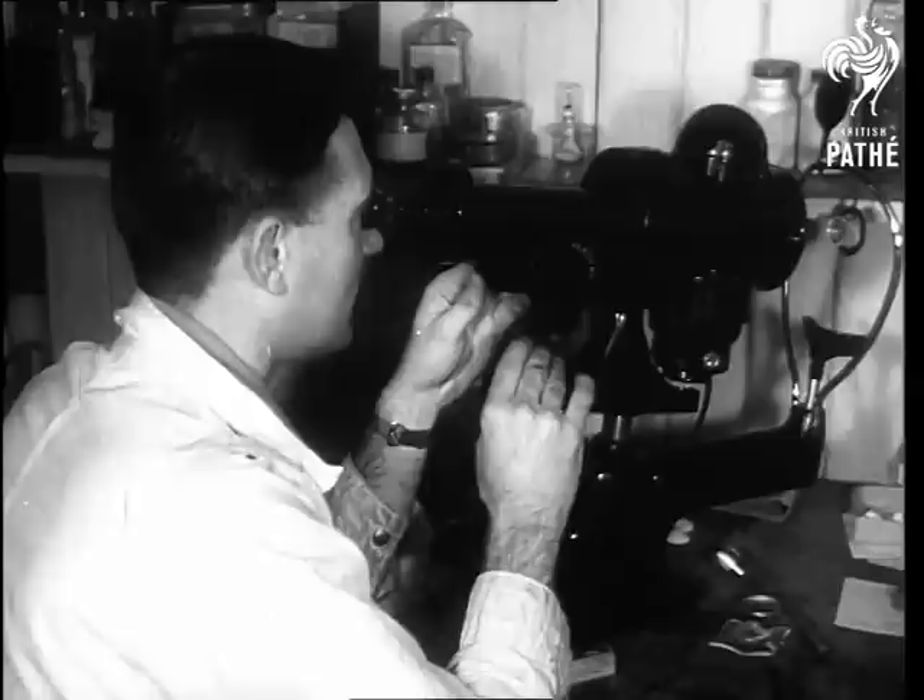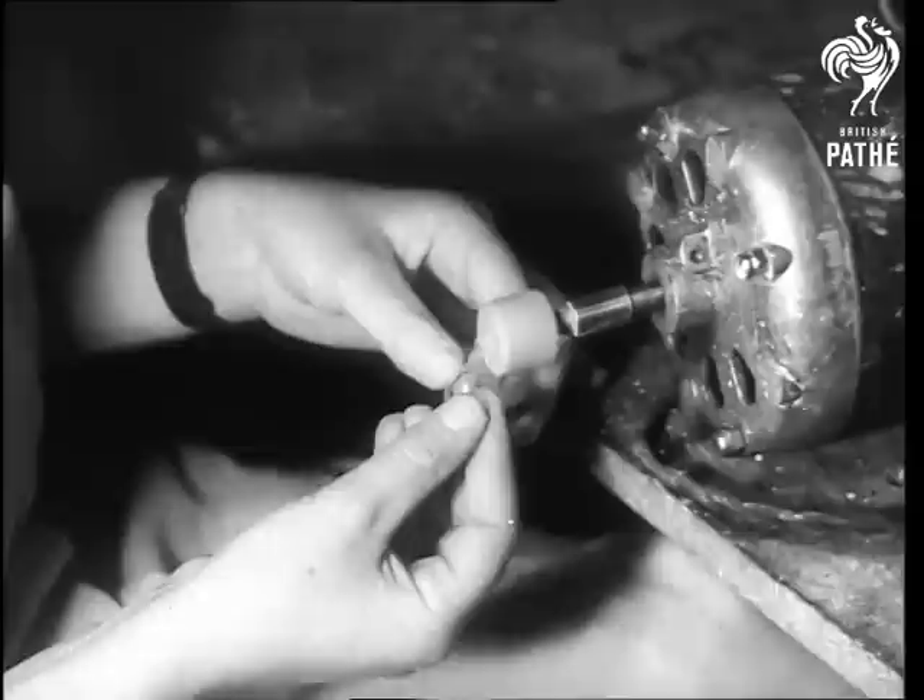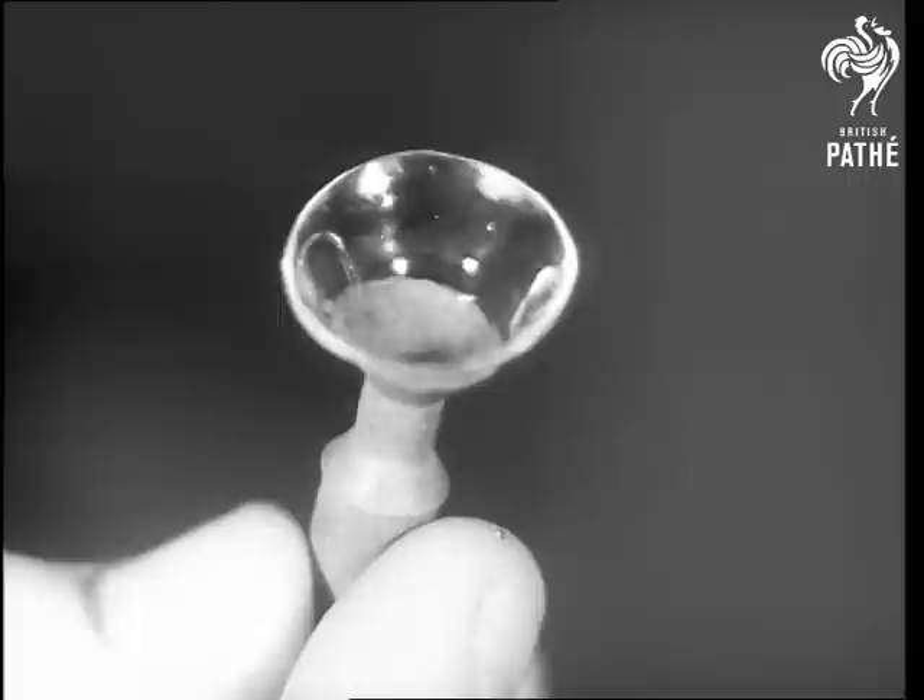Instruments measure accuracy, determining if the lens fulfills its optometric prescription. Then the tiny eyeglass receives a final buffing. There's still a spectacle case to leave lying about, but of course it's smaller — just to make it harder to find.